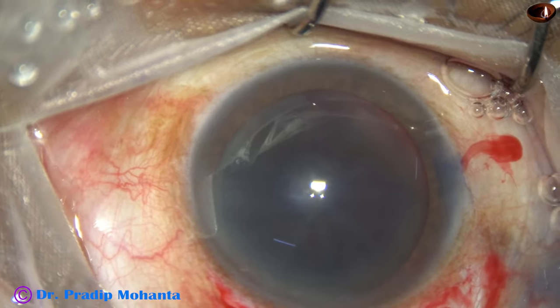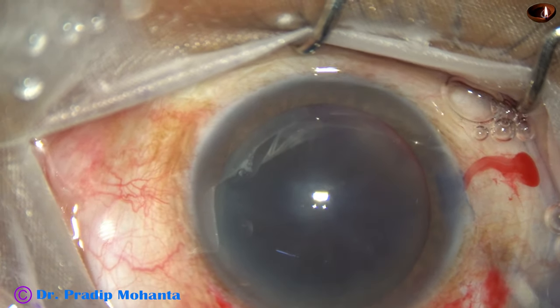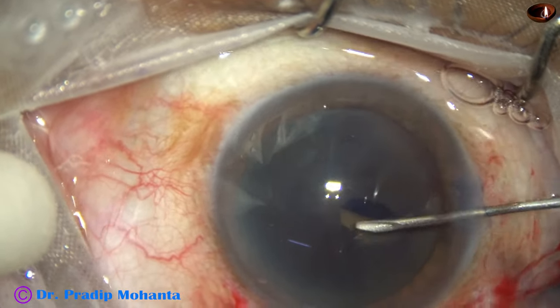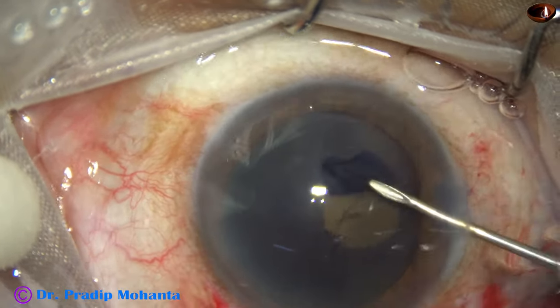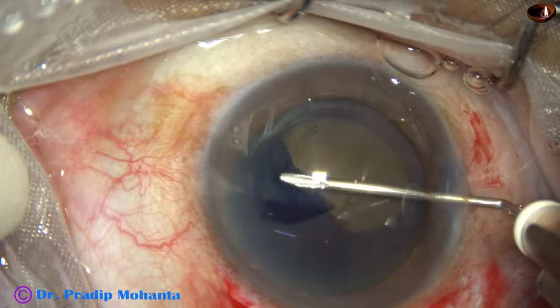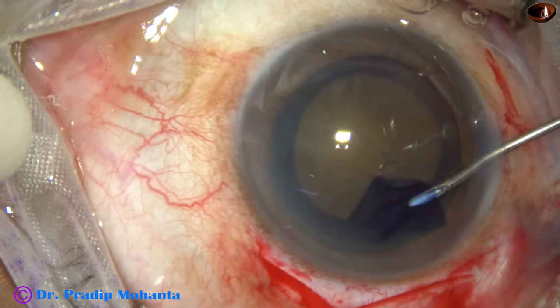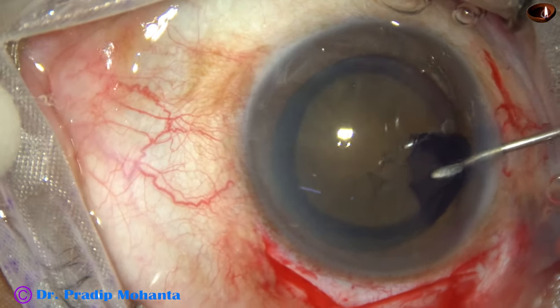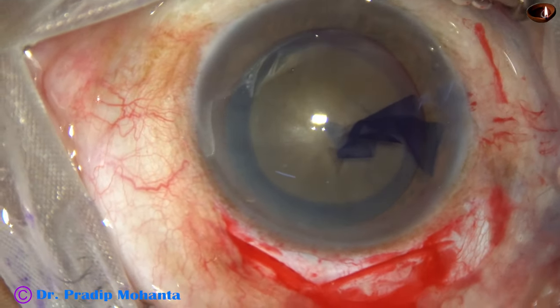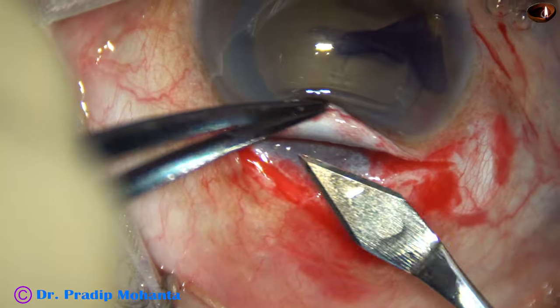With the help of a cystitome — a 26-gauge bent needle — capsulorhexis is being done. The capsule is incised, a capsular tag is raised, and this capsular tag is pushed towards 3 o'clock, then pulled from 3 o'clock towards 9 o'clock, giving us a good rhexis. This is a hard cataract — nuclear sclerosis grade 5 — so we need to do a large rhexis and keep that in mind.